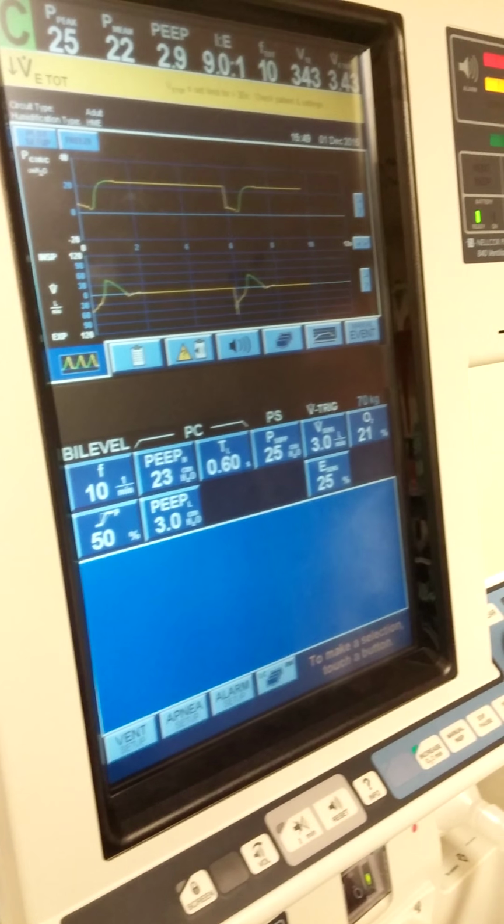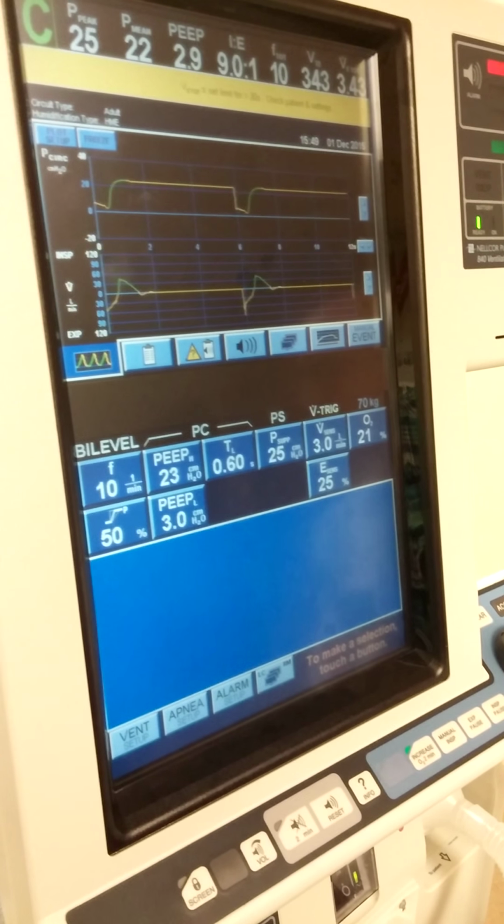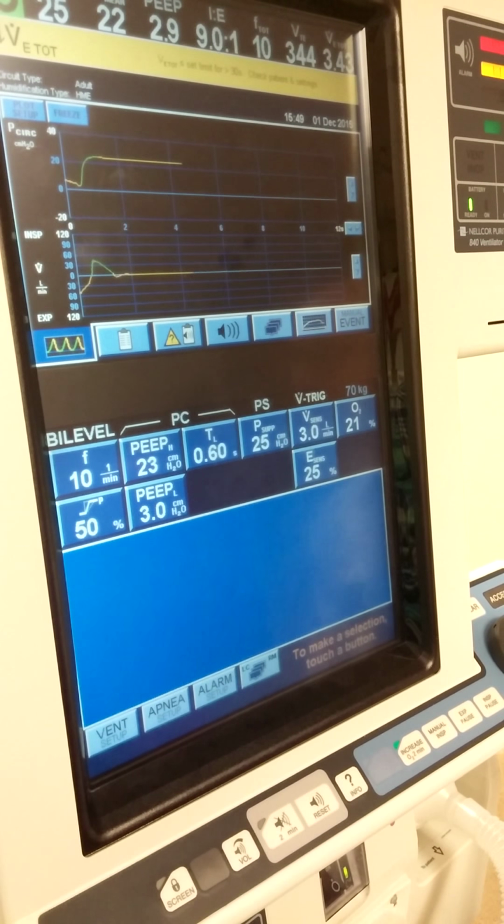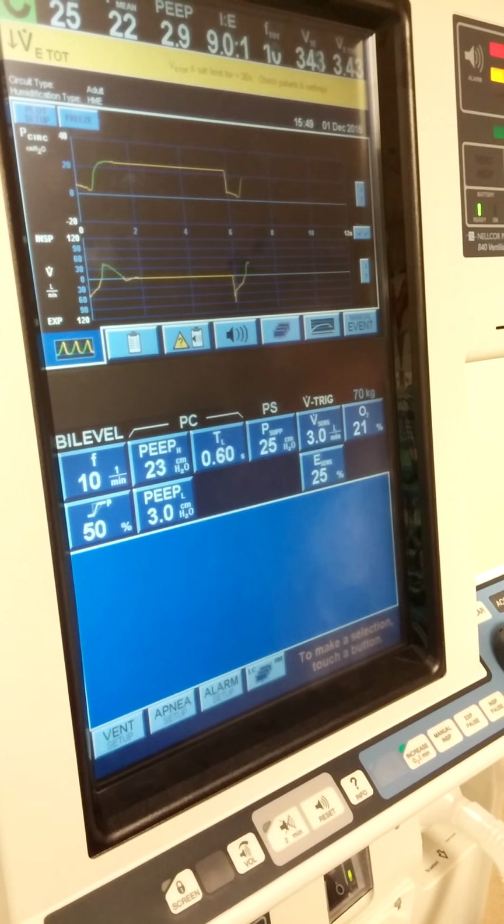I think I saw it once. Were they in APRV or were they in Bilevel? The respiratory therapist was like, I don't really understand this.